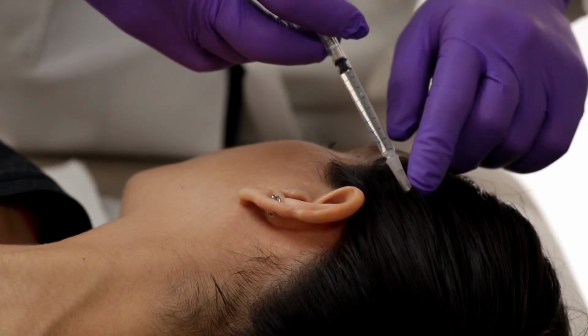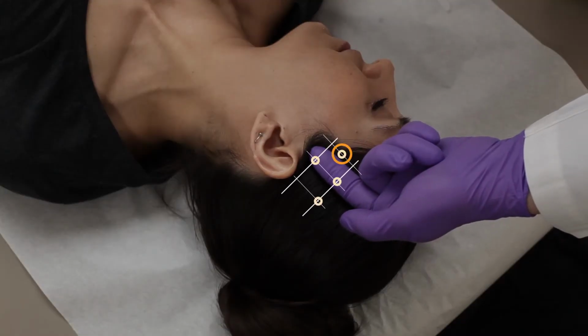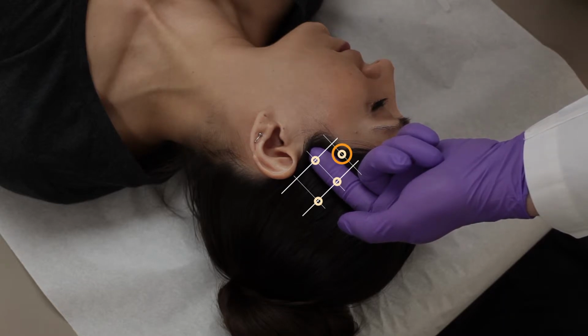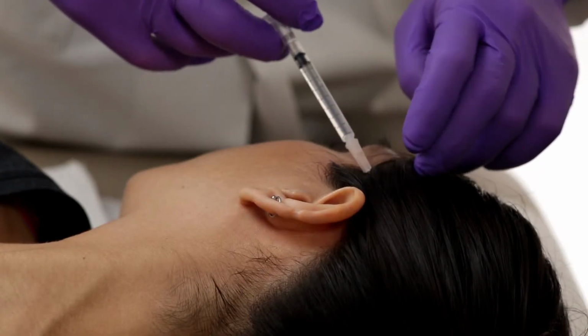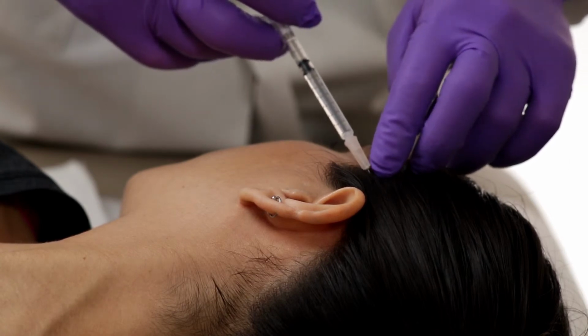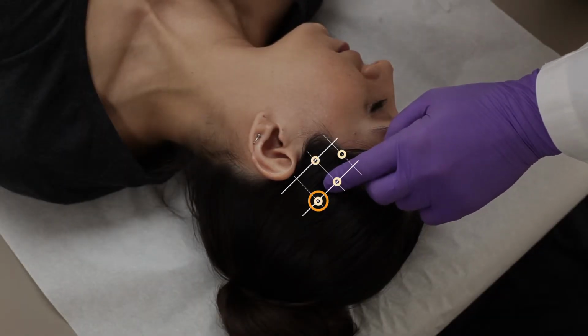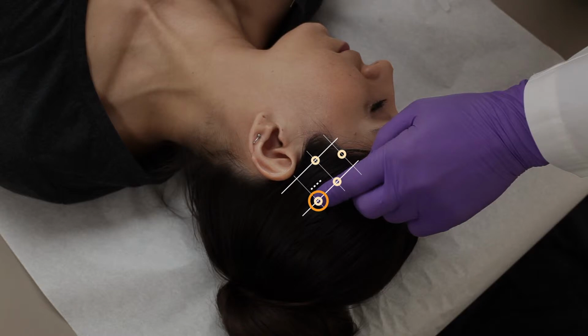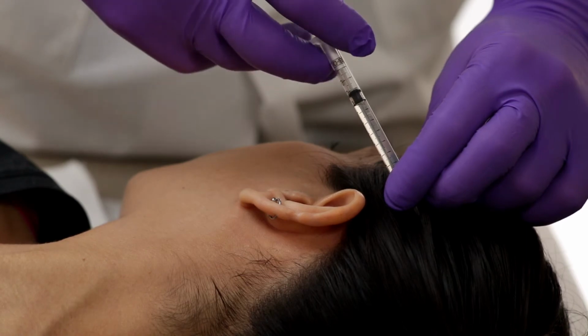For the third injection, move forward toward the face, approximately 1.5 to 3 centimeters or 1 to 2 fingers' breadth from the first and second injections. Make the third injection halfway between injections 1 and 2 and in line with the corrugator injections. This injection should still be within the hairline. For the fourth injection, move approximately 1.5 to 3 centimeters or 1 to 2 fingers' breadth back from and in line with the second injection and in line with the mid portion of the ear. Make the injection. Repeat the 4 injections on the contralateral side.